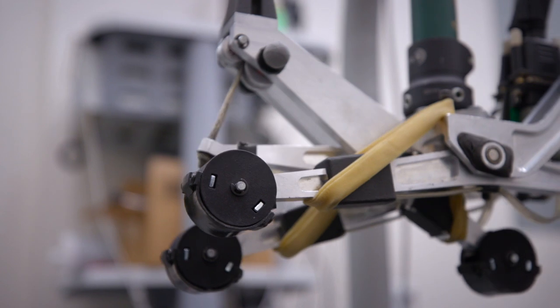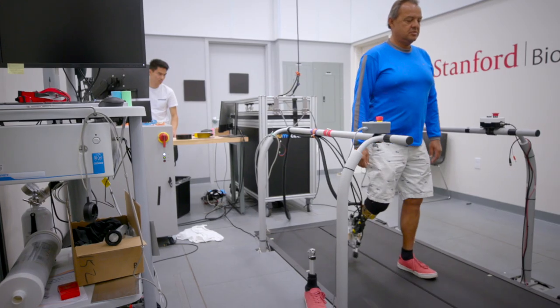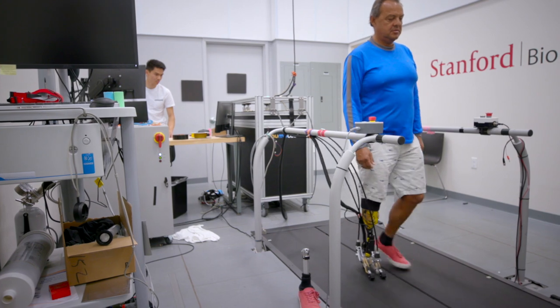One of the things we're excited to do is translate what we find in the lab into lightweight, low-power, and therefore inexpensive devices that can be tested outside the lab.